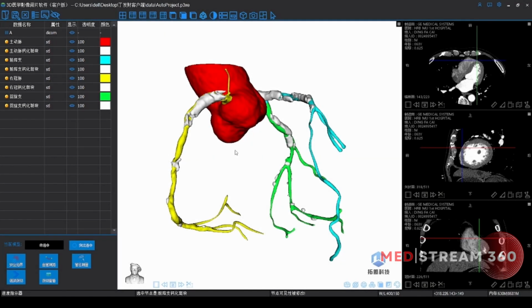angiography. We have shown this system many times, and just like the audience online asked in the previous case by Professor Li Yue, we think this unique technique, the intelligent visualization system for coronary CT angiography, will be a useful method, a weapon for complex PCI.